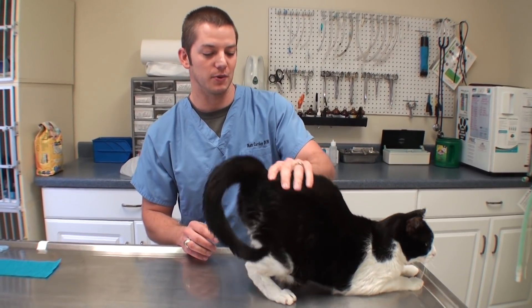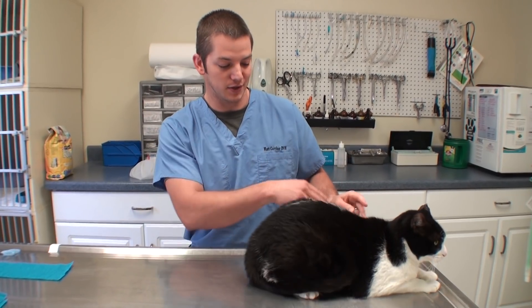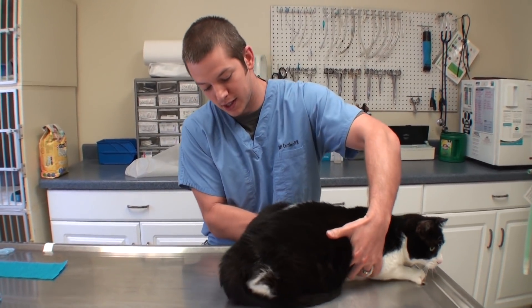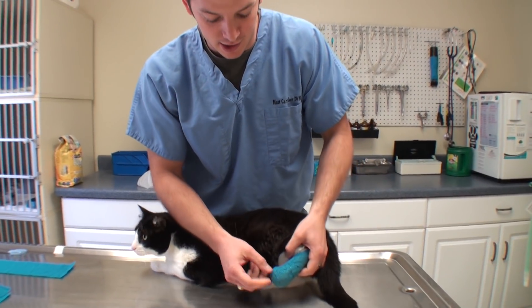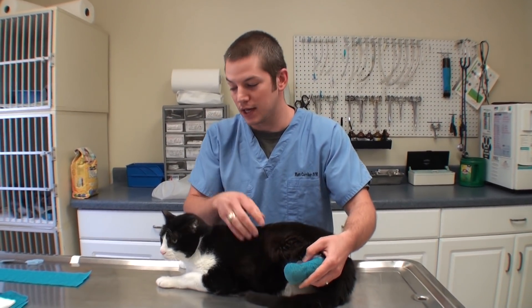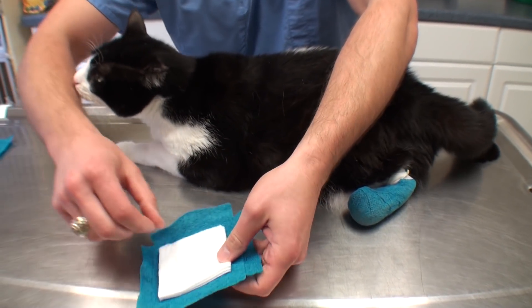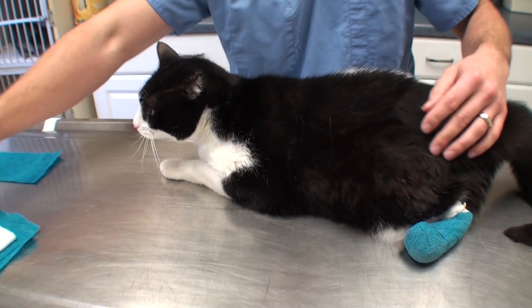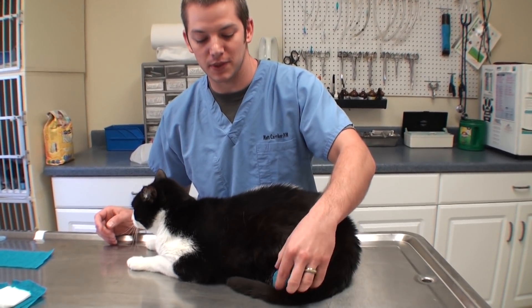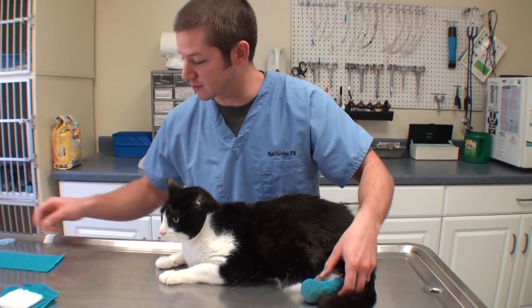He's a cat I wouldn't normally do this on, but he's just so good. He really likes us and we really like having him here, so we've just been keeping him here and doing it basically for free because we like him so much. We've done probably five surgeries on his foot. I really want him to keep that leg. What we're doing now is re-wrapping his foot and changing the bandage every day. I'm making a little boxing glove pad full of Neosporin and putting that on there every day to make sure it doesn't get infected.